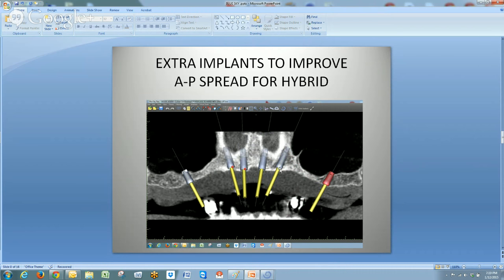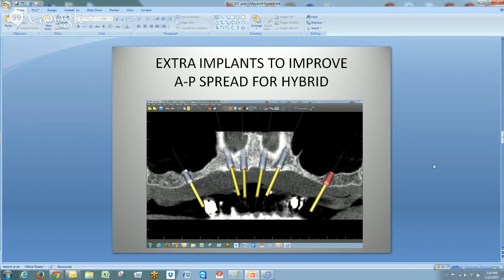One thing I do when I plan these cases — for hybrids and cases like this that might be transitioned — is use custom abutments, the yellow posts. I make them 17 millimeters long for planning purposes so that when I put the implant in, I know exactly where it has to go and can determine the implant length accordingly. It's a big help — you measure from the incisal edge down 17 millimeters and it shows you where the implant has to start.